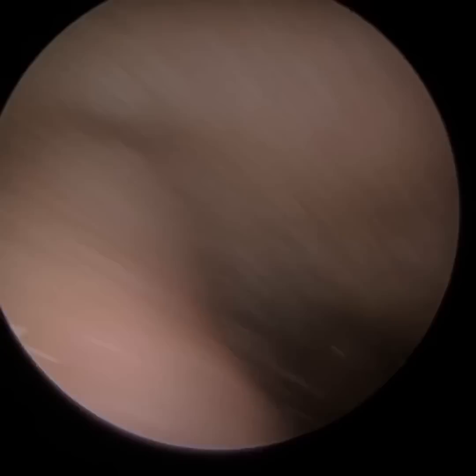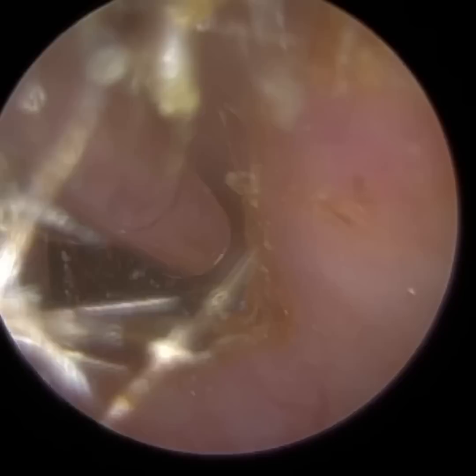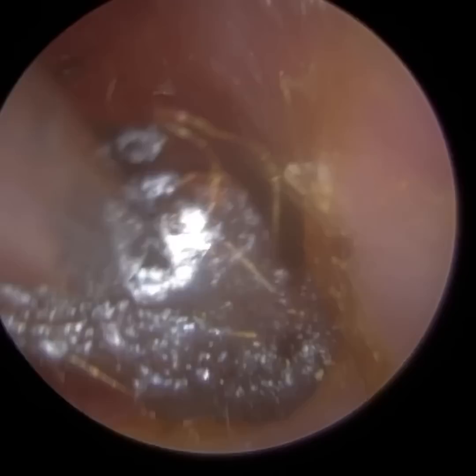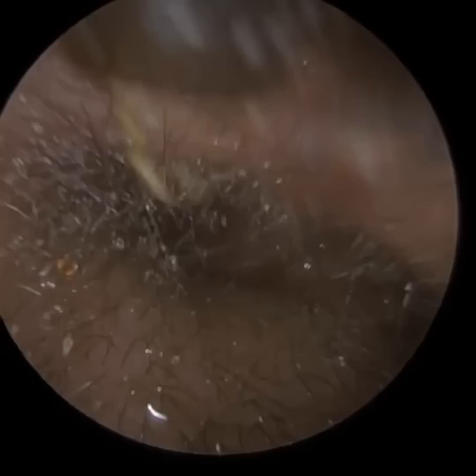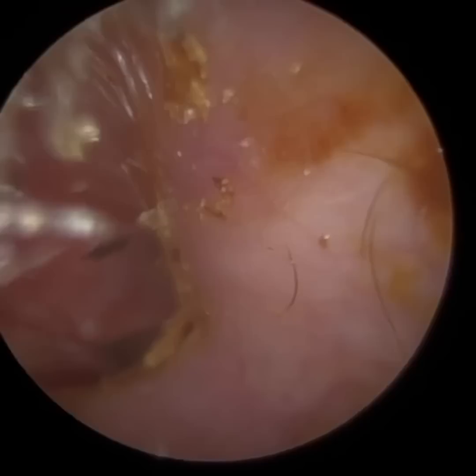You can see there's a little bit on the eardrum. I'm just going to use a fine-end suction probe to get that off the eardrum. You can see how the ear canal goes upwards — in a way, that has potentially protected the patient's eardrum from trauma. If the ear canal is completely straight, it's more likely that a cotton bud or other device goes straight towards the eardrum. So this is their left ear complete, and we're just going to have a final view. The patient's very nervous, but we just want to clear the blockage, which we have.